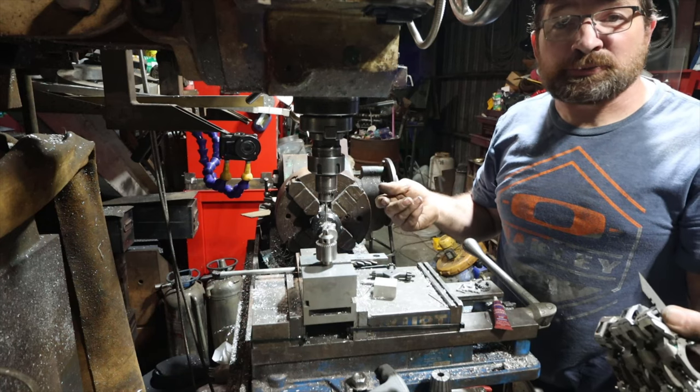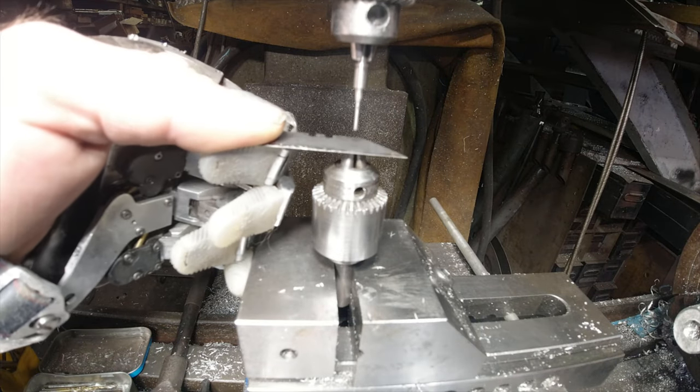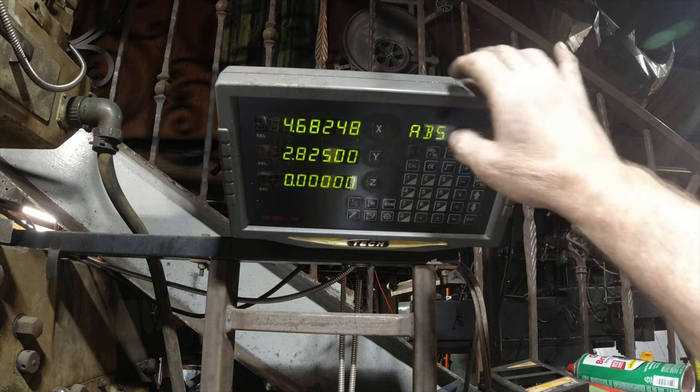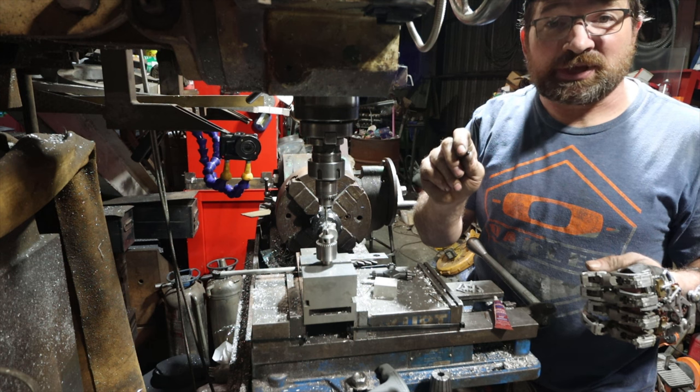Next I set the minimum height for the Z. I do that by putting a razor blade on top of the lower drill chuck and zeroing the DRO. By doing that it should help you from pushing the rivet through the bottom of the side plate.